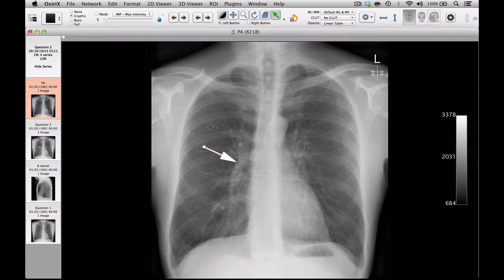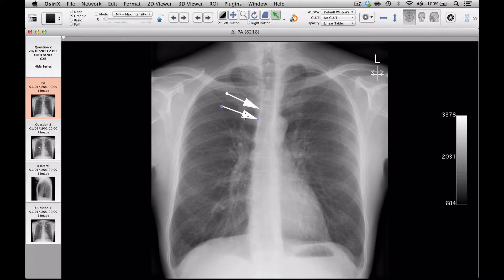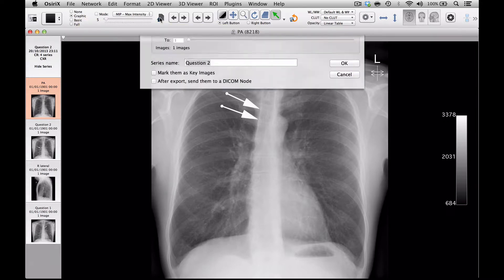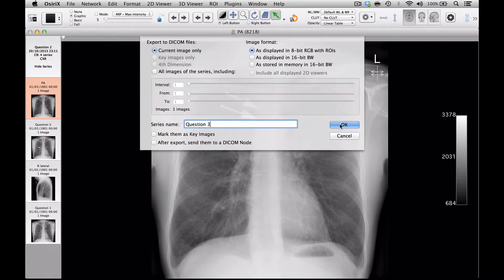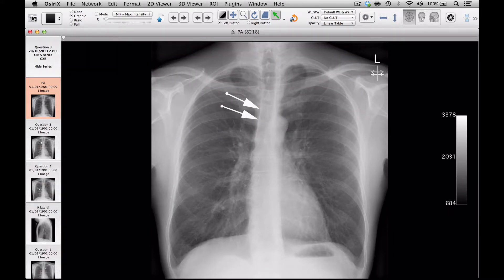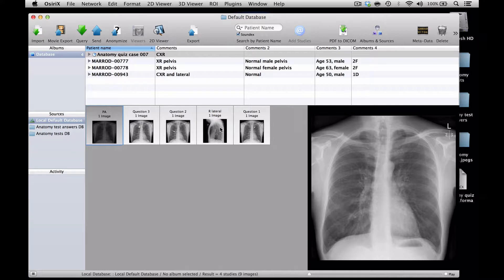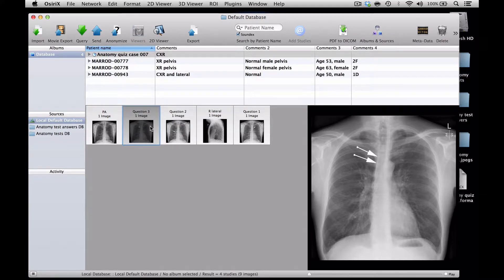If I go back to my original image, let's point this now maybe at the paratracheal stripe. For some structures it's actually quite useful to have more than one arrow, so on this one I might point two arrows at the paratracheal stripe. I'm now going to export this as Question 3. So if I now look back at my database, I have the original image and then I've got Question 1, Question 2, and Question 3 — but they're not quite in the order I'd like them to be in.